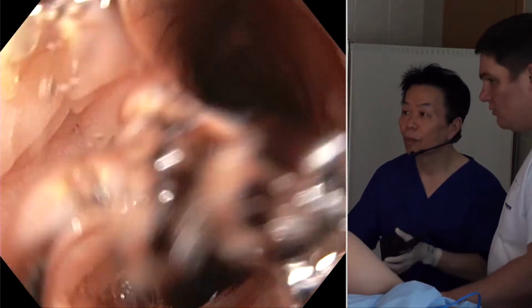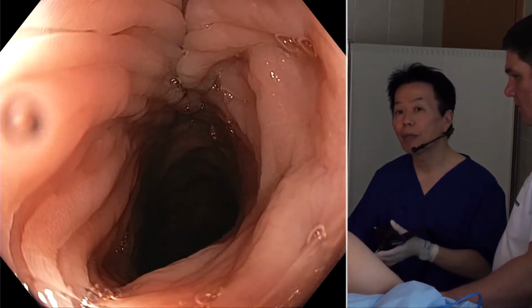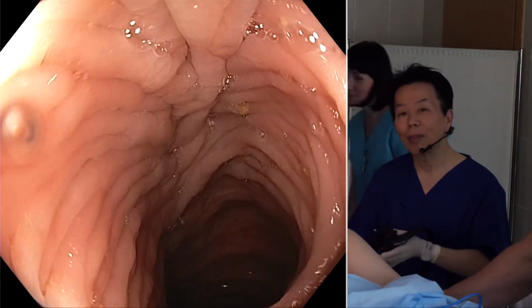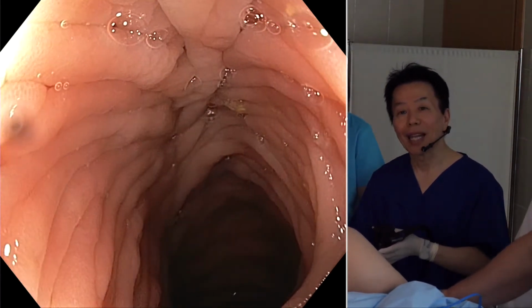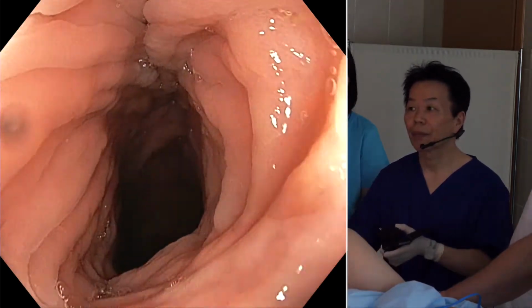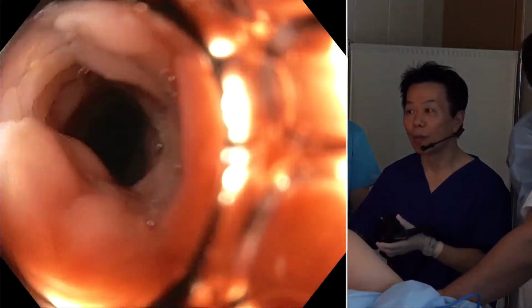Tell me please, when you use simethicone to prepare the bowel, 1 day before the procedure or 2 days before the procedure? On the day of the procedure, in the morning, the patients take purgatives, 200 milliliters each time, maybe 15 minutes apart. And for the last dose of 200 milliliters, we put simethicone into the purgative. So simethicone is very useful to prevent the bubbles formed.